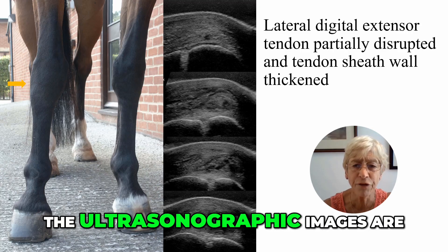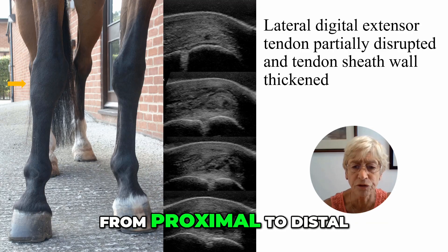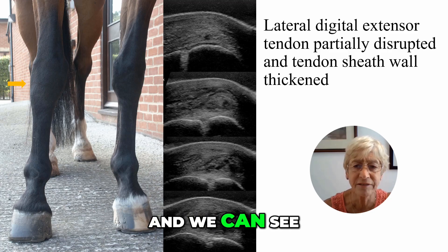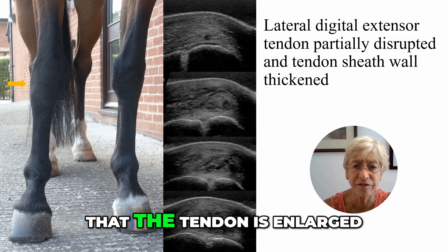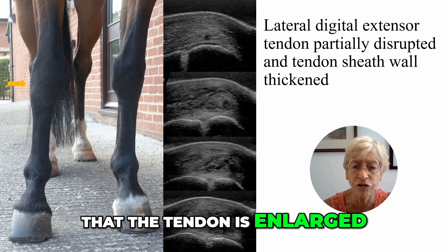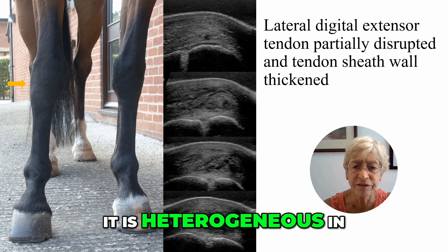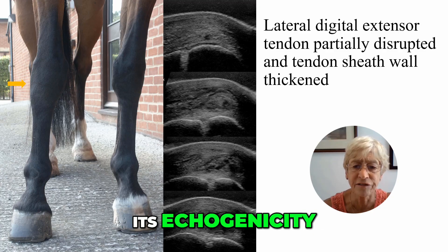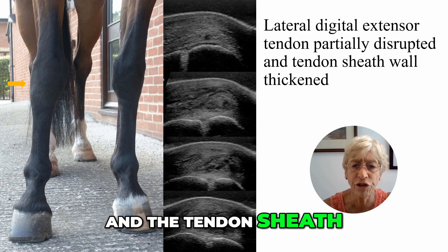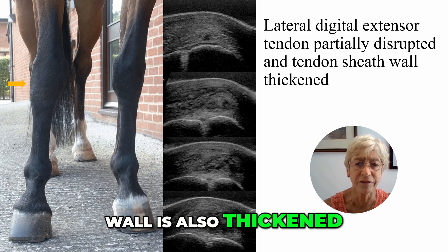The ultrasonographic images are from proximal to distal, and we can see that the tendon is enlarged. It is heterogeneous in its echogenicity, and the tendon sheath wall is also thickened.